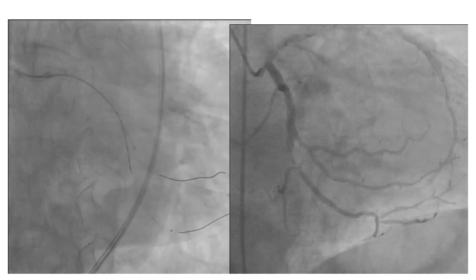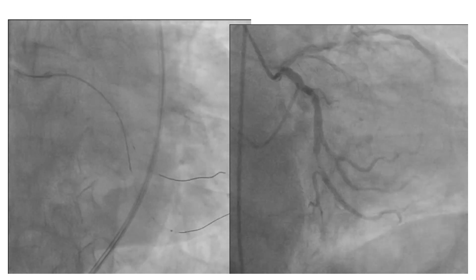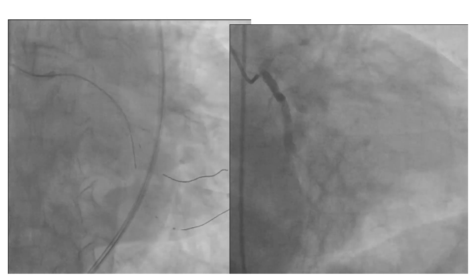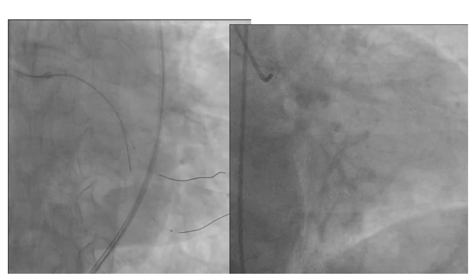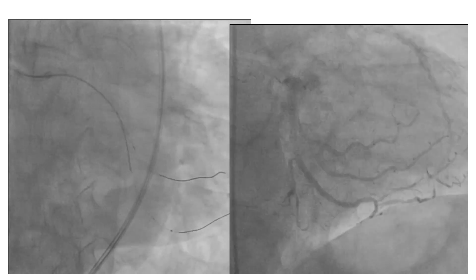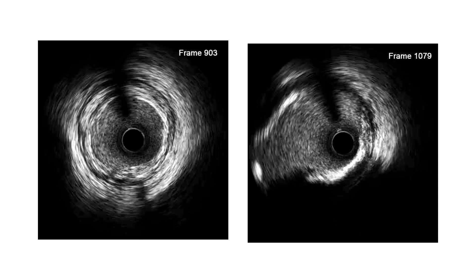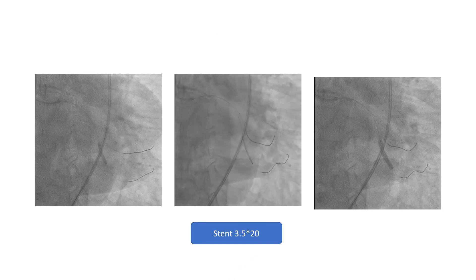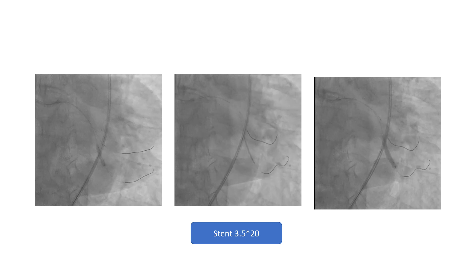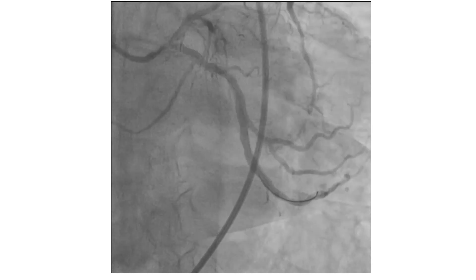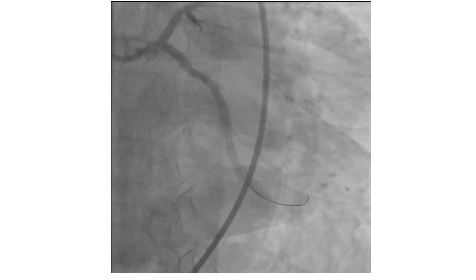We then engaged the left system and wired the circumflex again with the diagnostic angiogram as a roadmap. IVUS was done, using two landmarks: a second wire placed in a large branch of the OM to avoid stenting at the bifurcation, and the IVUS catheter dot itself. We confirmed a good landing zone distal to the bifurcation. The artery was prepared, predilated, and stented using a 3.5 by 20mm stent, dilated with an NC balloon inflated up to 18 atmospheres. The mid-circumflex lesion was non-critical by IVUS.